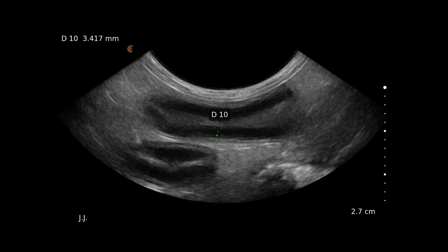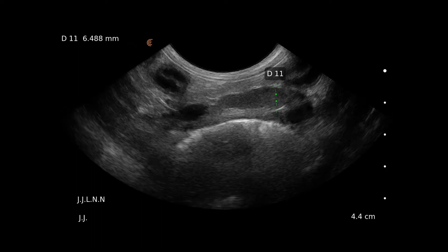Here we have another loop of duodenum in longitudinal, with a more normal measurement and a very normal-looking wall. Here's a duodenal lymph node — they tend to be quite long and mildly hypoechoic compared to surrounding tissue. It should be under a centimetre in dogs, which this is well under.